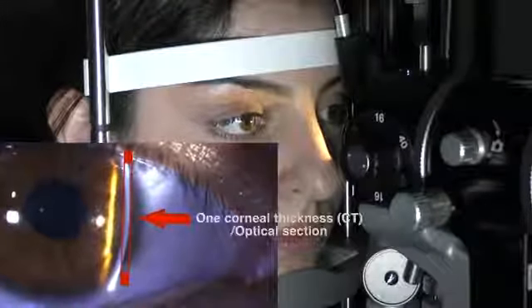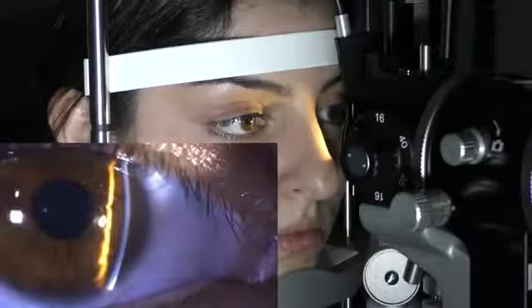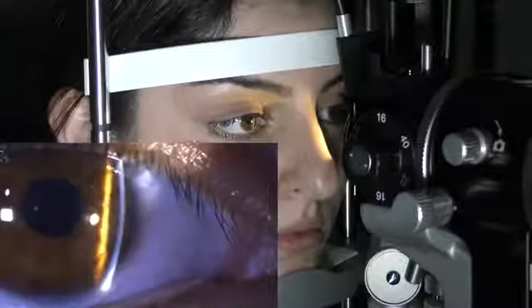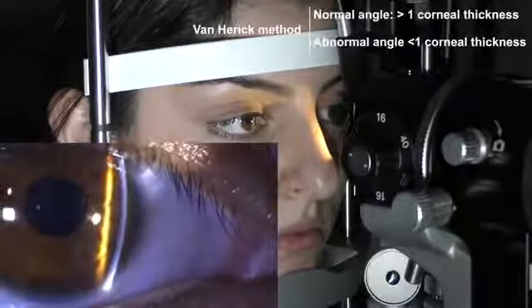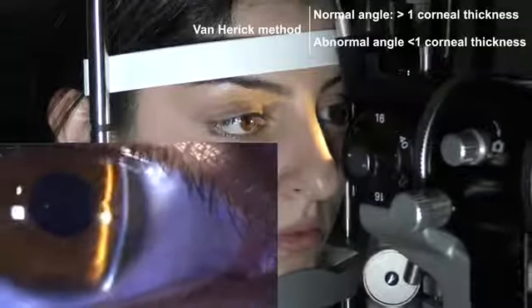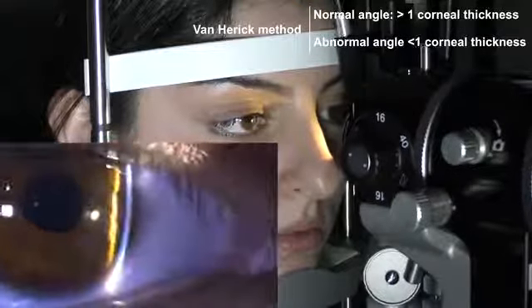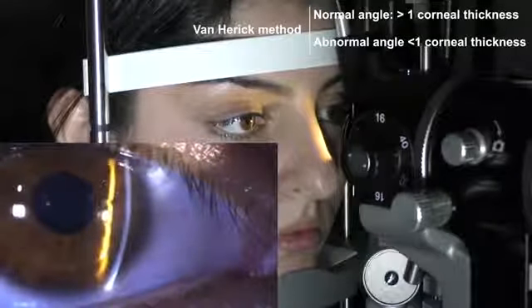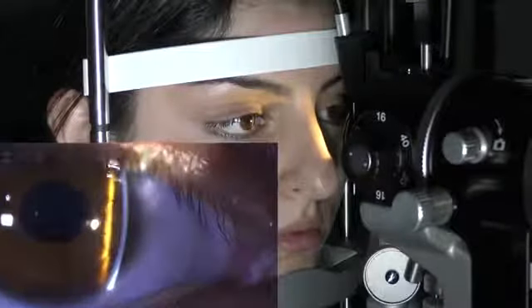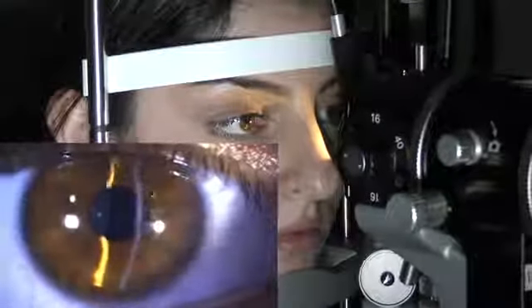So here, for example, I would say this is maybe about 2, maybe 3 corneal thicknesses deep in the periphery of the cornea, which means that the angle is open. If you're worried about a narrow angle, a lot of times you'll have less than 1 corneal thickness between the two beams. So look for that, and that's a sign of a narrow or closed angle. Then you need to move on to a gonioscopy exam. With gonioscopy, you can actually look at the angles and the structures to see if it's open or closed.